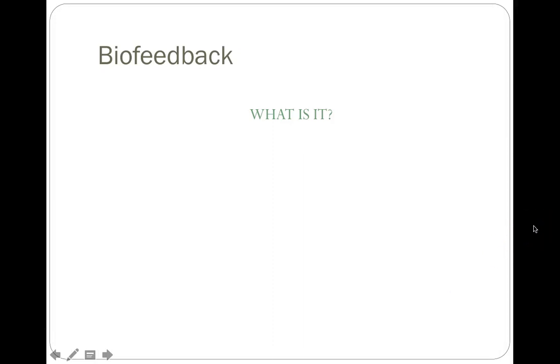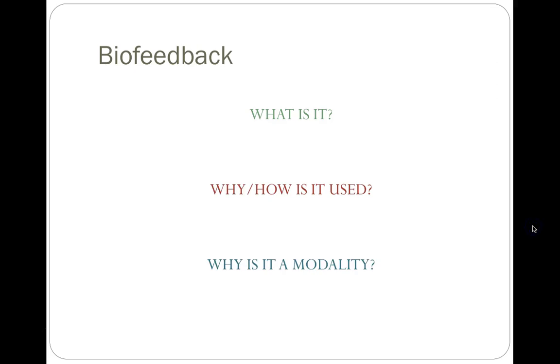So biofeedback, what is it? If you break down biofeedback, it's the idea that you are giving feedback to the individual, or the individual is getting feedback on some sort of biological function in their body. Most of the time, we are talking about muscle feedback in this case.